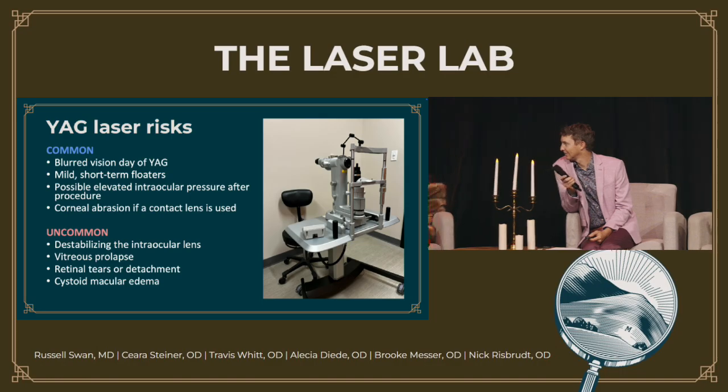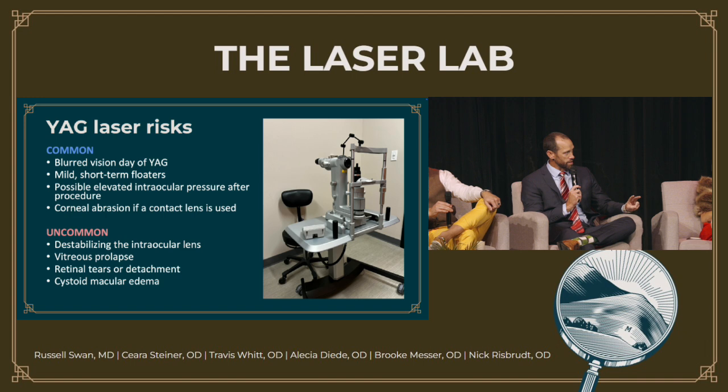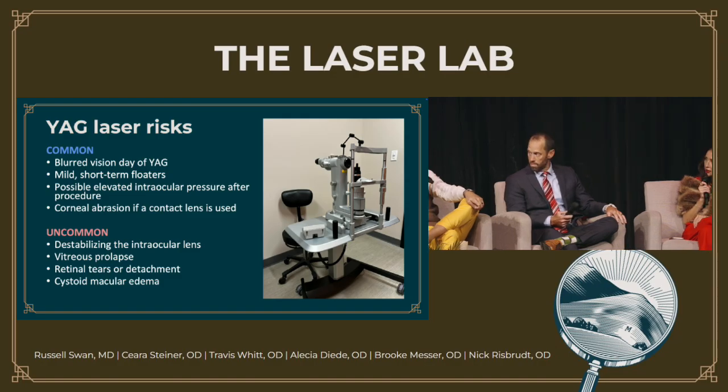I think I go through every patient. I tell them there's risk for swelling or inflammation in the back of the eye, and there's risk for retinal tear or detachment. I tell them these are the same risks that you took on when we did your cataract surgery. I kind of quote ballpark about 1 in 10,000 for a post-YAG, depending on axial length and a few other components there. I probably quote it closer to 1 in 20,000 as far as the potential for those, but I quote them every time and then tell patients about 20% of patients will notice some floaters, which can linger for a few weeks, but potentially be stubborn and hang out for a few months. Nick, is he right? Yeah, I agree.